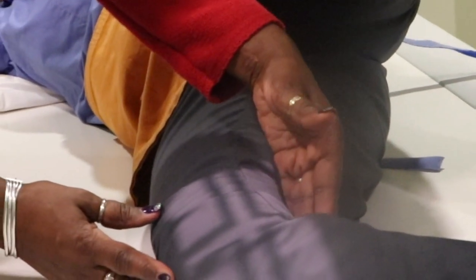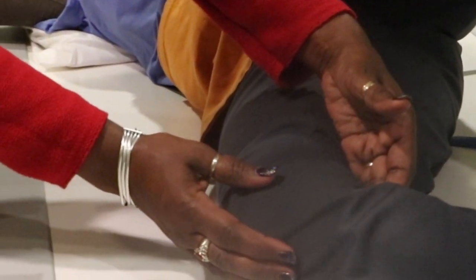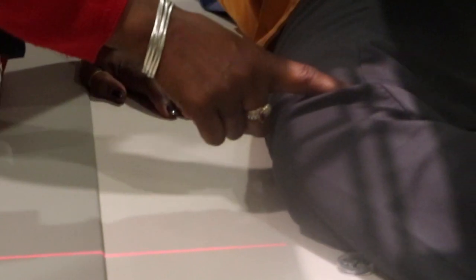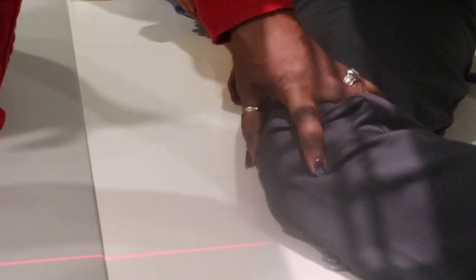Now what I'm going to do also, here's the posterior portion of her knee joint. Here's the anterior surface. Make sure this line comes down her femur, so it's aligned with her femur. You're on the condyle, so just now put your angle on 5 to 7 degrees.